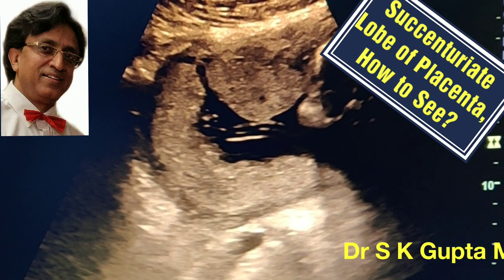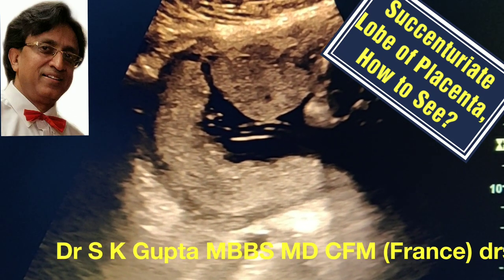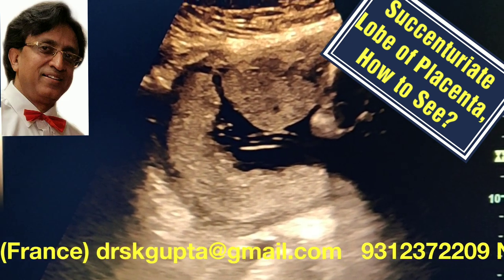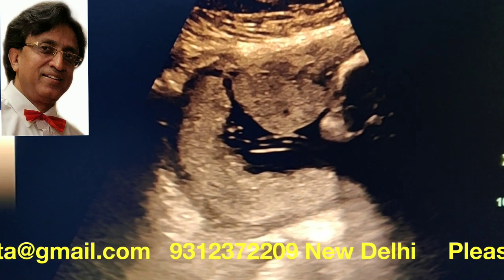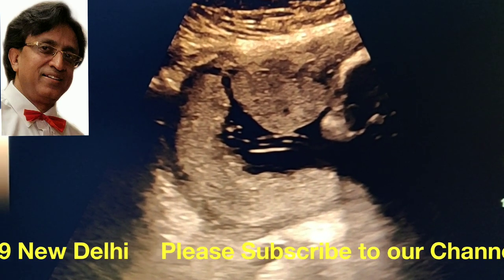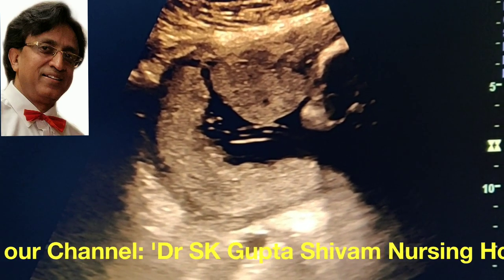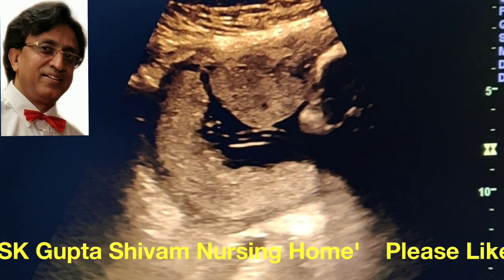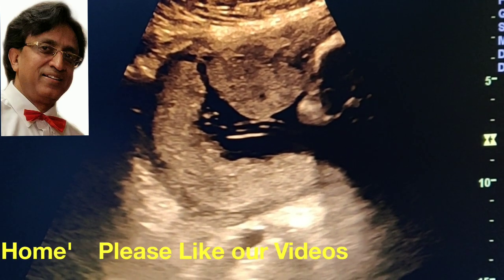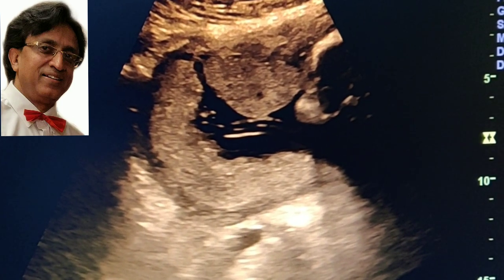Today I am going to present a case of succunturiate lobe of placenta. A succunturiate lobe of placenta is an accessory lobe of placenta which is situated slightly away from the main placental tissue. It is important to identify this lobe because if it is retained at the time of birth, it may cause postpartum hemorrhage.